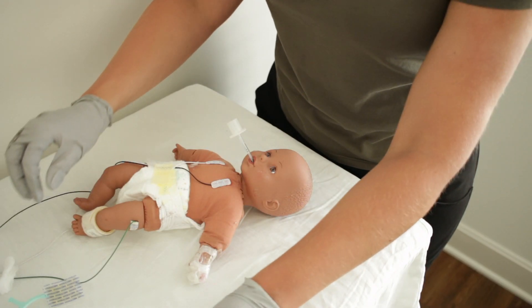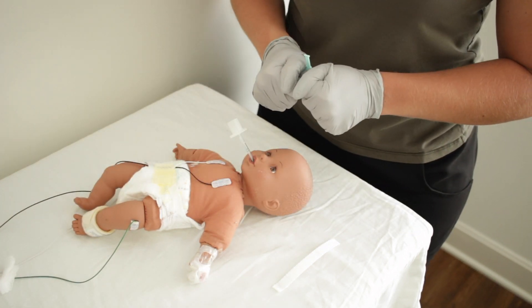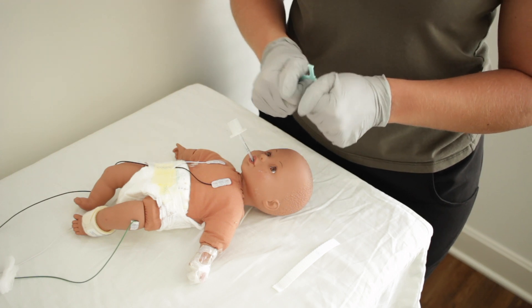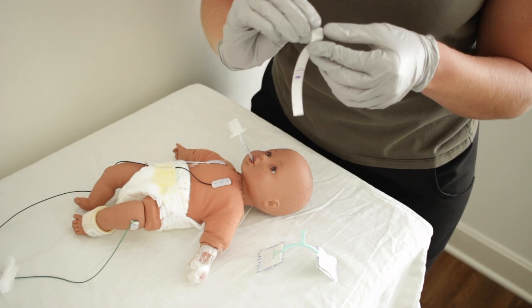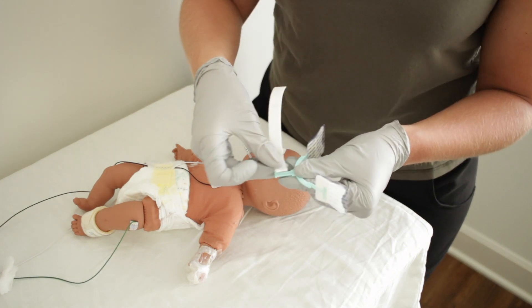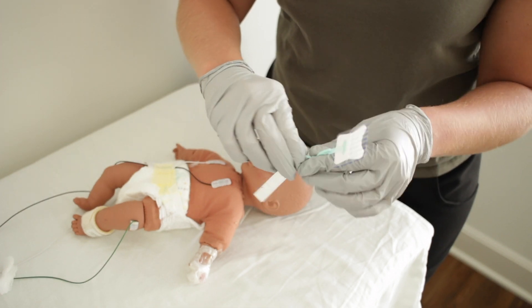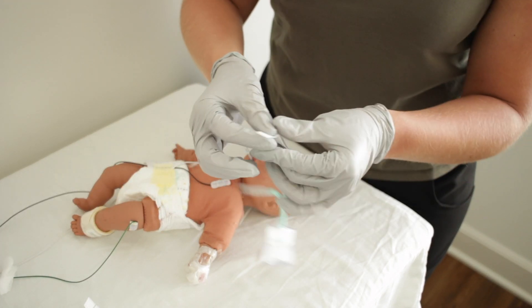After you have finished the preparation phase, you are now ready to apply the neobar. You will need to start by activating the adhesive on the tabs of the neobar. You can do this several ways: you can either hold the tabs in your hands to warm for about 60 seconds, wrap a heel warmer around the tabs, or hold the tab underneath the radiant warmer for about 15 seconds. After your tabs are warm, I find it easiest to wrap the tape around the platform of the neobar once before applying it to the patient.